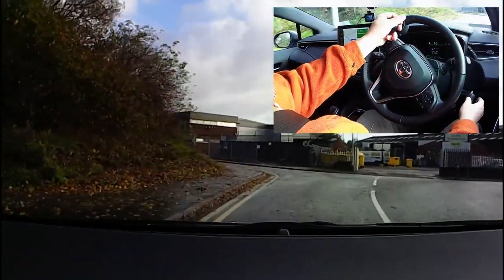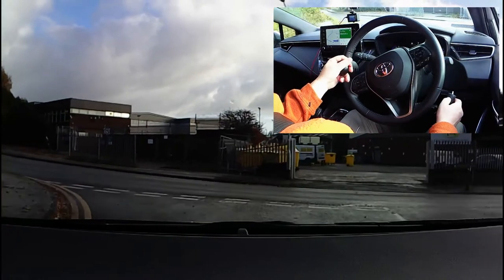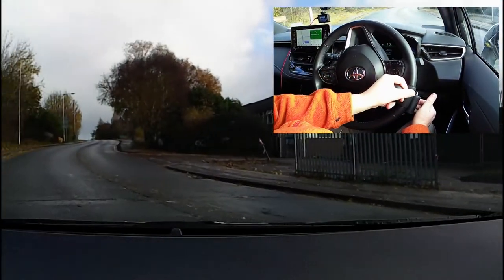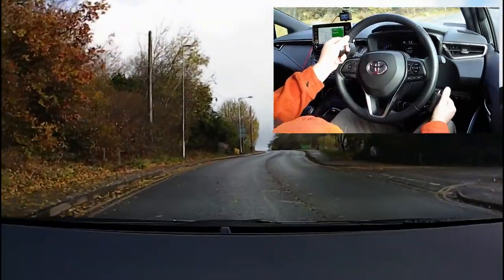Use my thumb to reduce my speed, having my fingers ready to take over if it's clear to carry on, then cancel the signal.